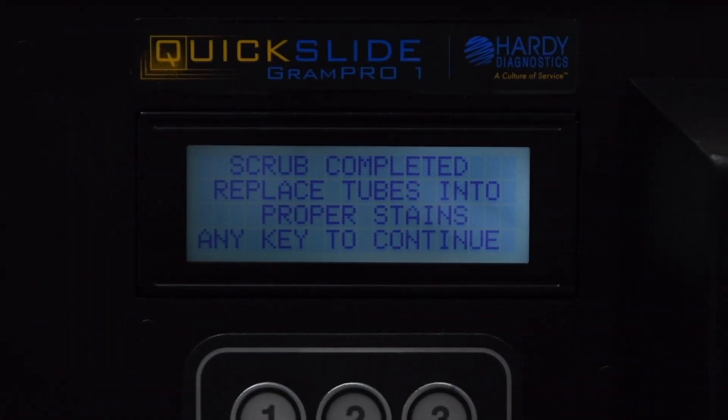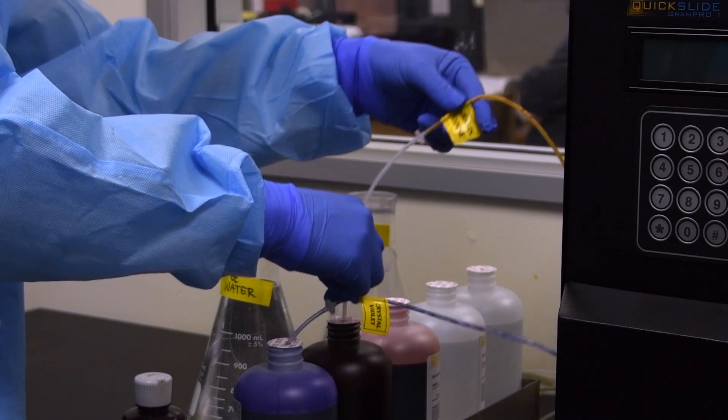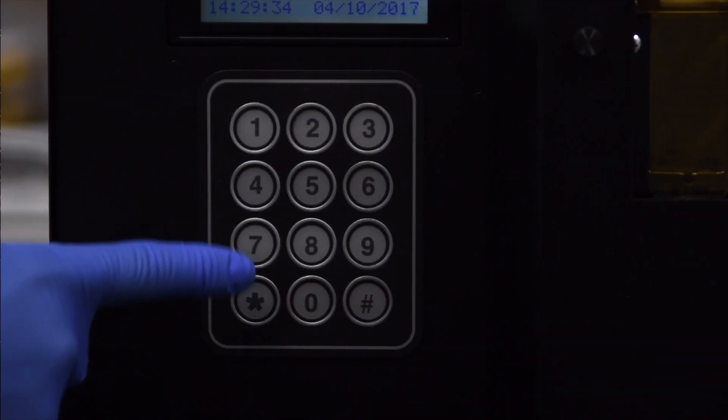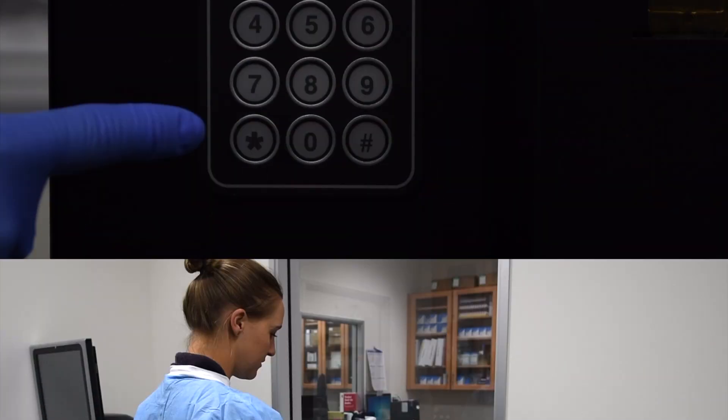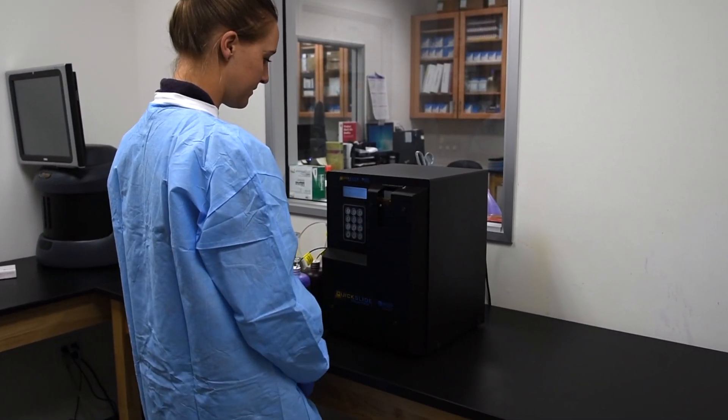When the scrub cycle is complete, place the cannulas back into their respective reagent containers, then press any key to continue. The lines will then be primed with reagents.